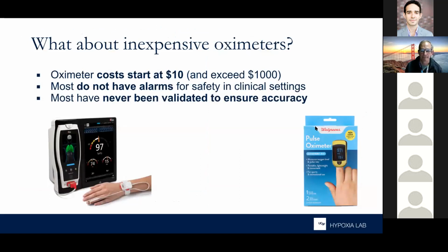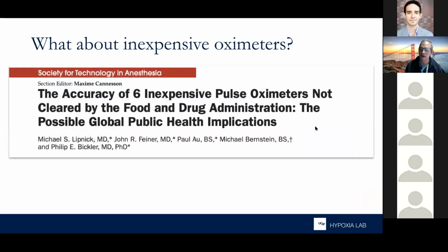Next slide. Inexpensive pulse oximeters raise a really good question. These are the oximeters that are being widely used in the COVID pandemic, and they're more frequently found in resource-limited settings. Many of them have significant limitations, and Dr. Lipnick's work has highlighted some of the errors that can occur. Next slide.